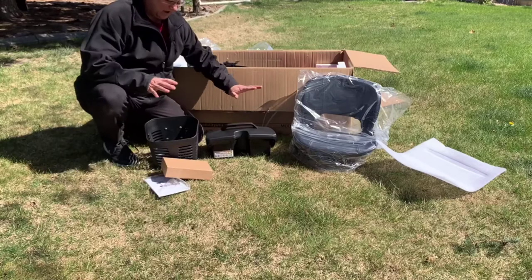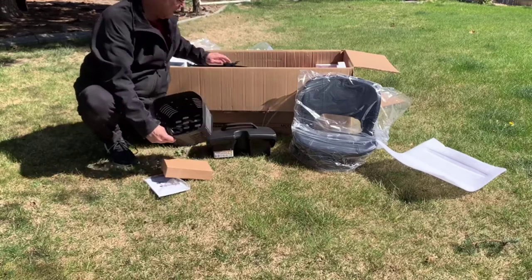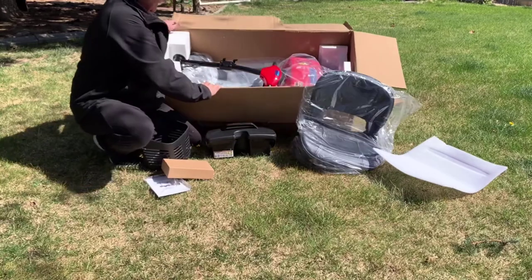As you take everything out, the top stuff is easy: the seat, the battery, the basket, and then we'll just go ahead and lift out the scooter.